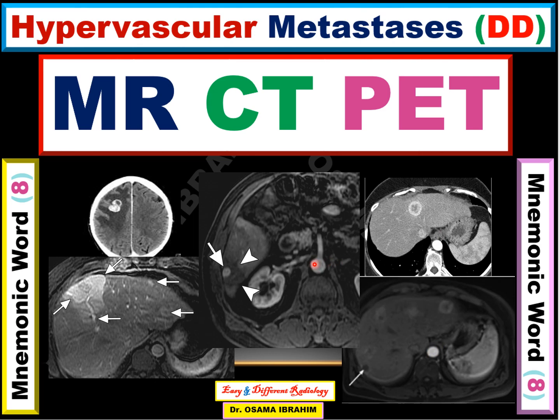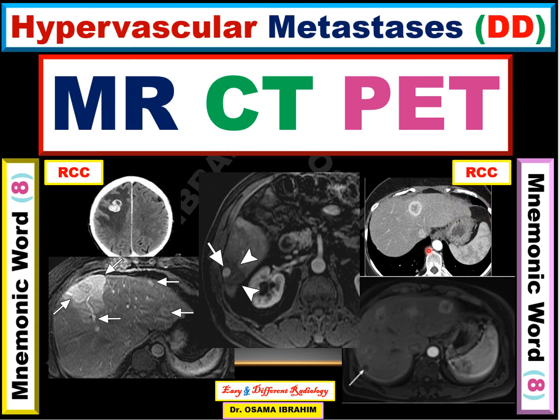This is MRI, this is CT, this is MRI, this is CT — all showing the aorta representing the arterial phase. So any lesion taking contrast in that phase represents hypervascular metastasis. Like this lesion in the brain due to renal cell carcinoma, one from MRCT. Or these lesions in the liver also from a known primary of renal cell carcinoma. You can also recognize the zebra spleen, which also represents the arterial phase.